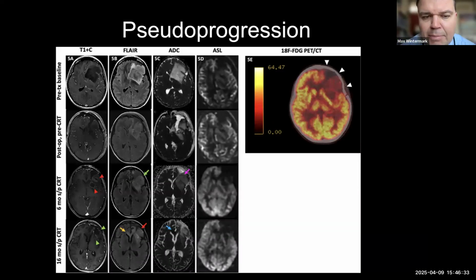And ASL has been used abundantly for different conditions, for patients with stroke, for patients with moyamoya, a very nice way to perform Diamox tests, because you can do ASL before and after Diamox, since you are not injecting contrast. You don't have to inject the patient twice. You just do ASL before and after. And it has also been used for patients with brain tumor.